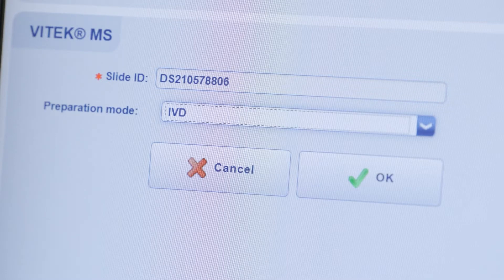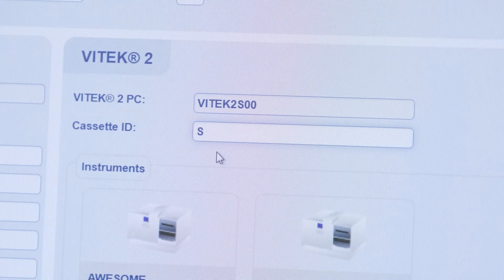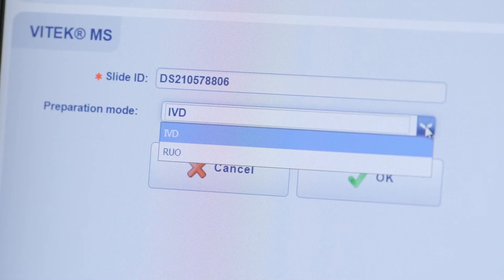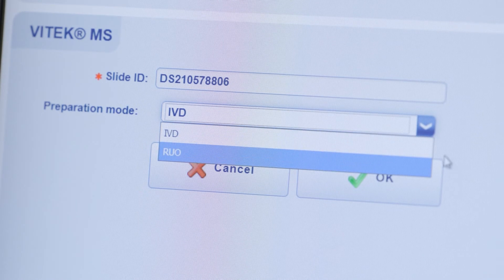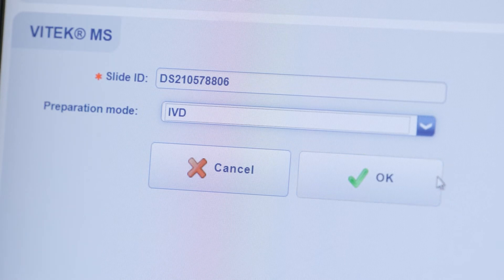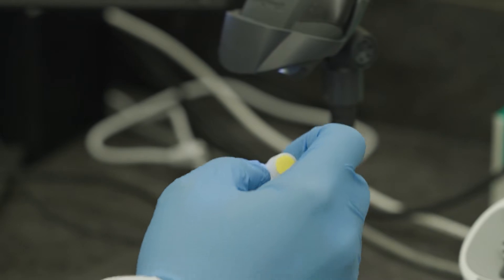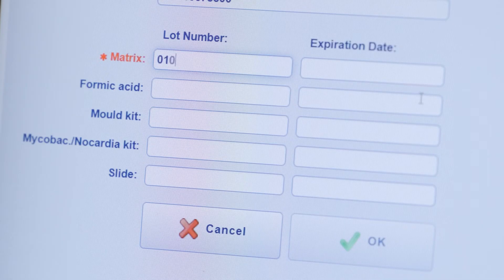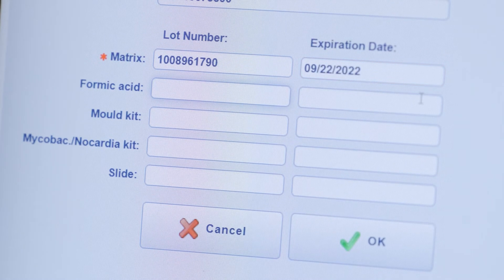Scan the Vitec MS target slide ID with a barcode reader or enter it using the keyboard. Enter a cassette ID. If RUO configuration has been installed, two modes are available for slide preparation. For routine clinical use, IVD preparation mode is recommended, and selected isolates may be requested for RUO analysis during the review process. Click OK. If reagent traceability is enabled, scan or enter the matrix lot number and expiration date. Hit Tab to complete entry of both fields. Enter the lot number and expiration date for other reagents if applicable.